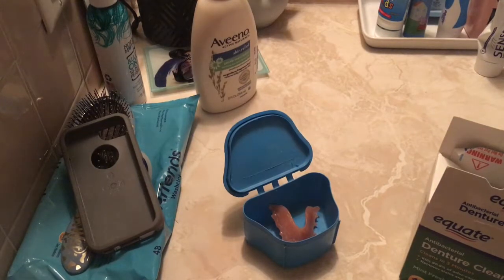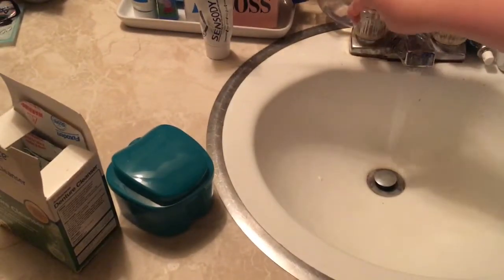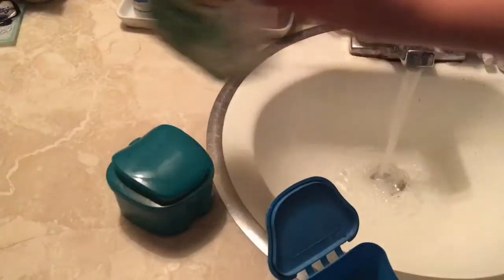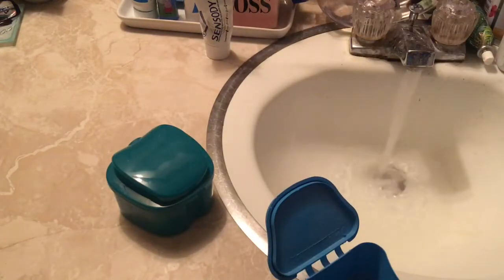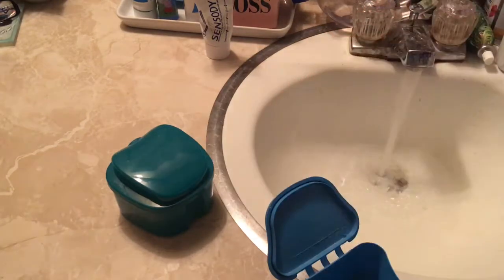I'm showing you what you're going to need. I have my tablets, my denture case, and my toothbrush. When you first get your flipper, you get a denture brush, but that's long gone — I lost it a long time ago, so now I just use a toothbrush. The tablets I got from Walmart.